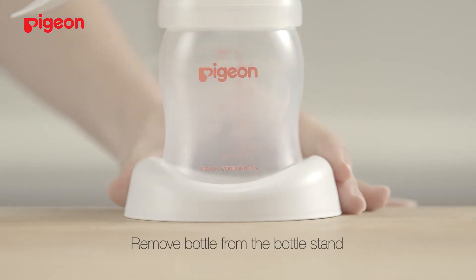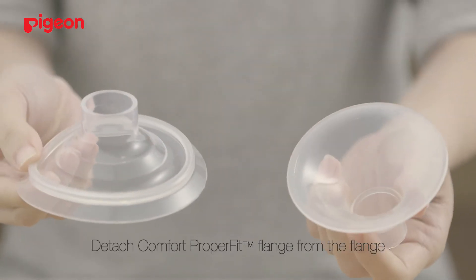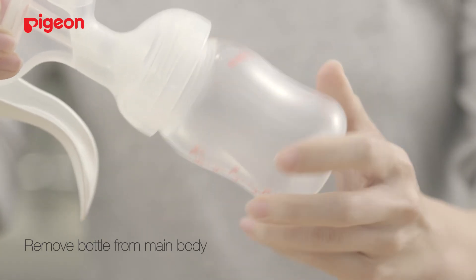To disassemble, remove the bottle from the bottle stand. Separate the flange from the main body and the Comfort ProperFit flange from the flange. Remove the handle from the shaft and then from the stem of the main body. Remove the bottle from the main body.